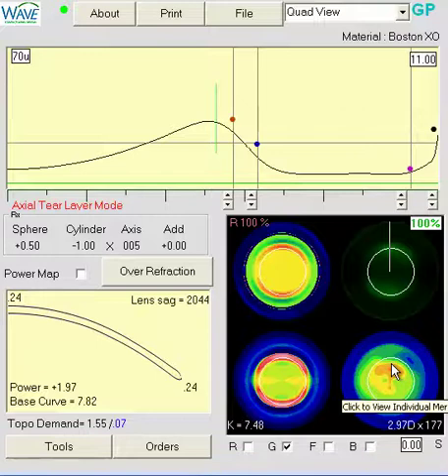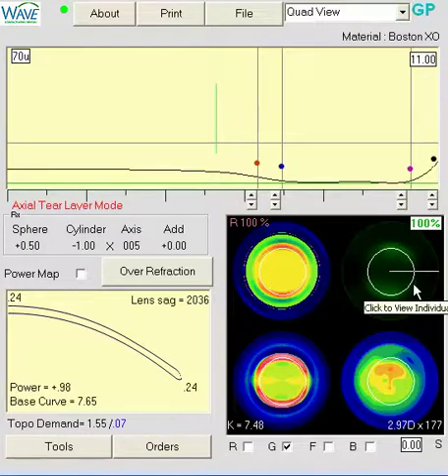It may not be a case that you want to mold at all. But I would not go to a freeform lens from the outset. I would go to a G-Sim first and see how that fits on the eye and see what kind of results you're getting. You can always troubleshoot from there.